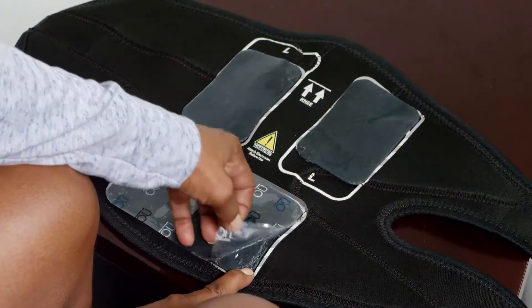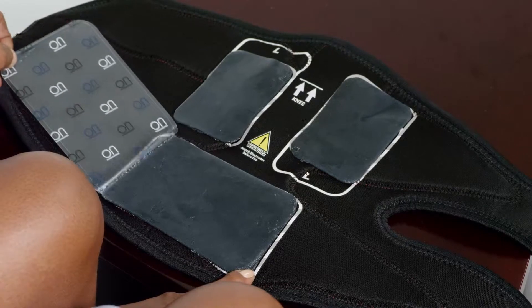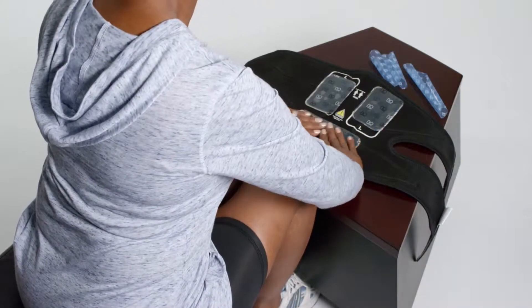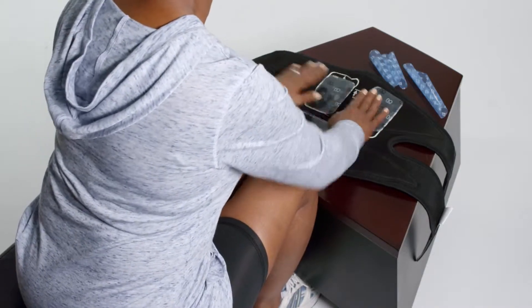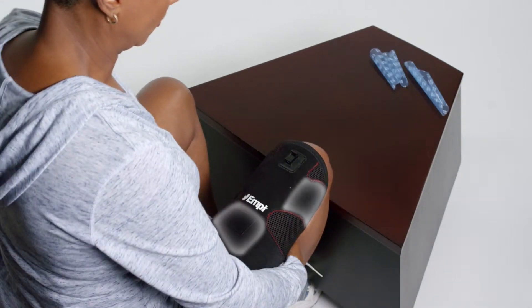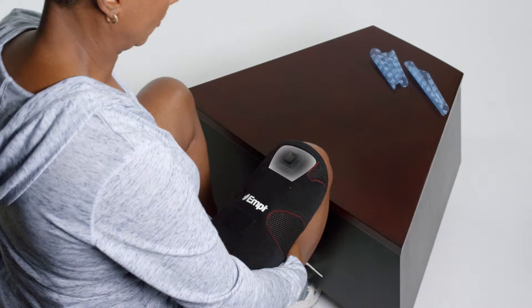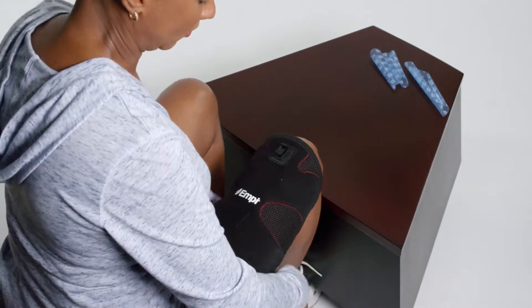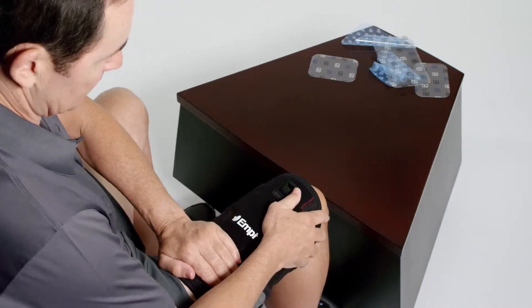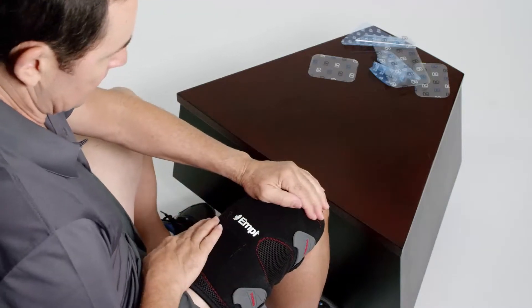Once the electrodes are in place, remove the clear plastic lining from the face of the electrodes and save it. Now place the garment on your thigh. The two smaller electrodes should be placed over the muscles just to the right and left above your knee, with the larger electrode toward the middle or upper portion of your thigh. The far end of the garment should be just above your kneecap and the white MP logo should be facing you and approximately centered on your thigh.